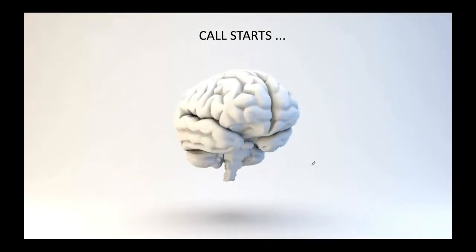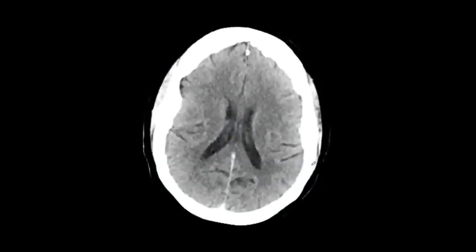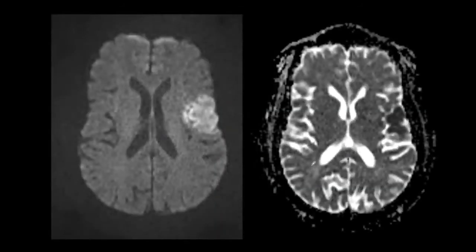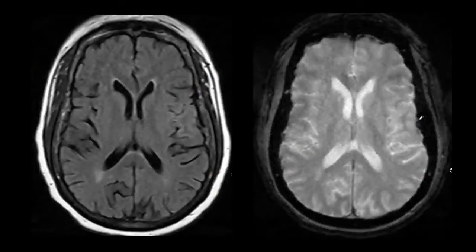First case: 72-year-old female with acute onset right facial droop, history of colon cancer with lung metastases and atrial fibrillation. CT head shows no obvious difference between the hemispheres — gray matter looks preserved, ventricles look alright. On MRI, the DWI sequence shows increased signal and the ADC sequence shows decreased signal in the left MCA distribution, in the region of the upper convexity — consistent with restricted diffusion.